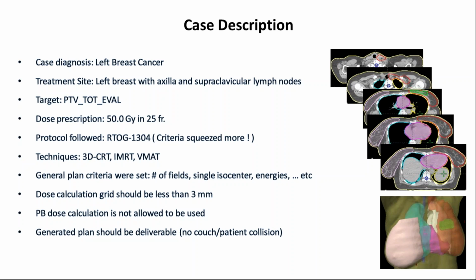And there were other requirements. But it is very important to know that it's not only important to generate a high quality plan, it's also very important to generate a deliverable plan. This means that when it comes to treatment time, it should also be cleared from collision.